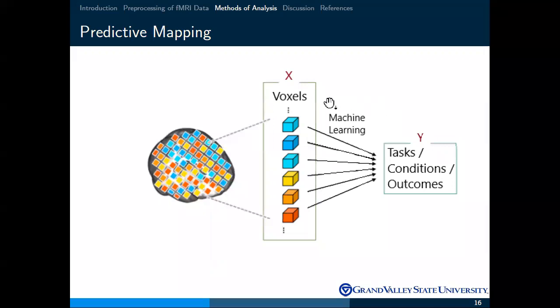Many of these papers make you sad a little bit inside, because this is a very high dimensional problem, with the number of voxels typically being around 100,000. For those with experience with machine learning, if you have 100,000 inputs in your design matrix, you can get very good at predicting things in your own data set, right?